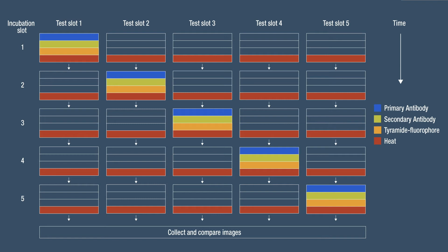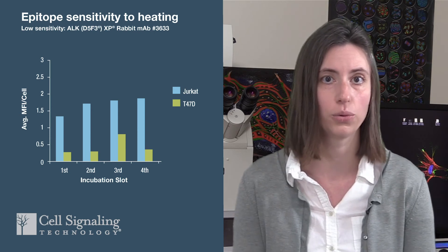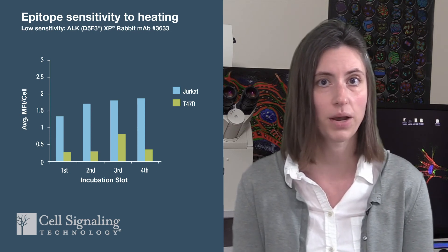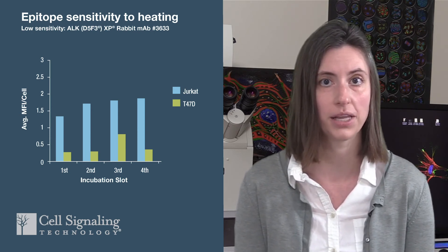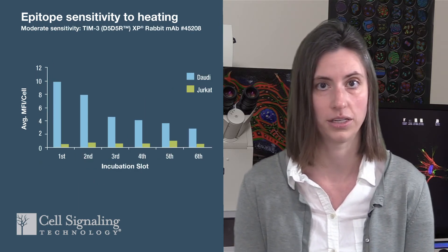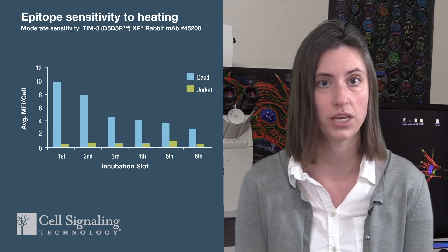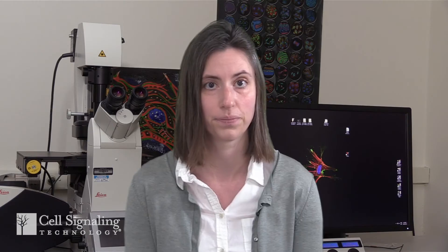So what can you expect to find when testing for sensitivity? First, some epitopes may be more tolerant, exhibiting low sensitivity to heating — antibodies to epitopes in this category may be placed in any order in the panel. Other epitopes demonstrate moderate sensitivity to heating, resulting in a gradual decrease in signal intensity with each additional round of stripping. Some epitopes will exhibit high sensitivity with a quicker loss of signal; these targets should ideally be stained early in your panel.